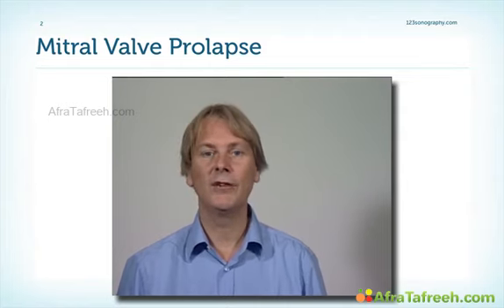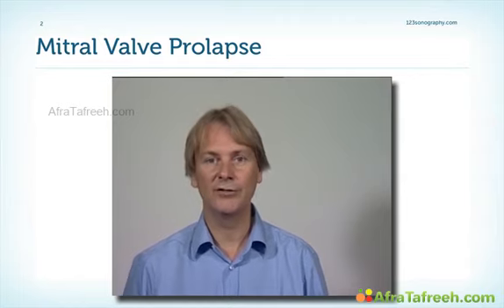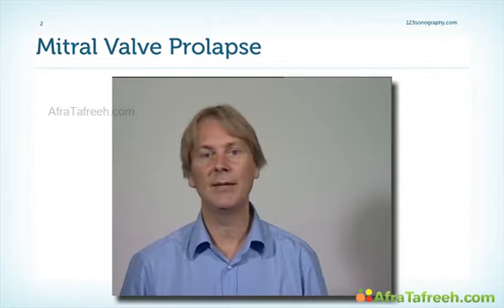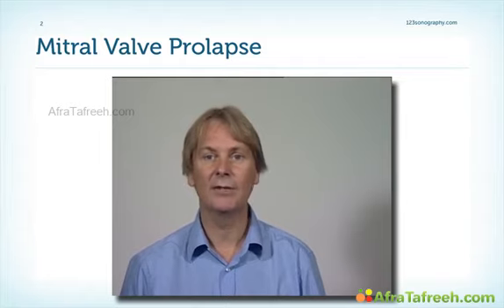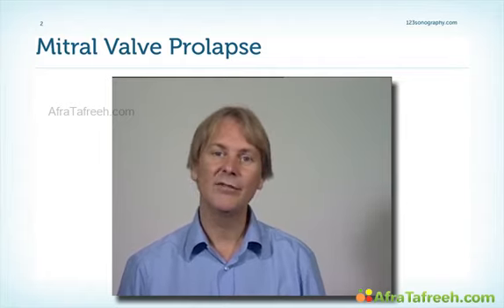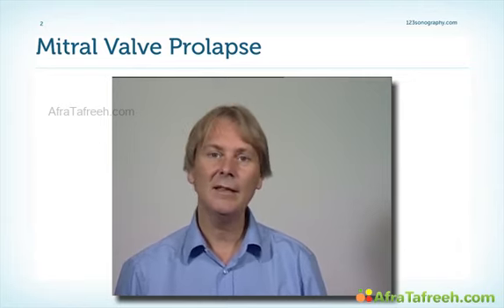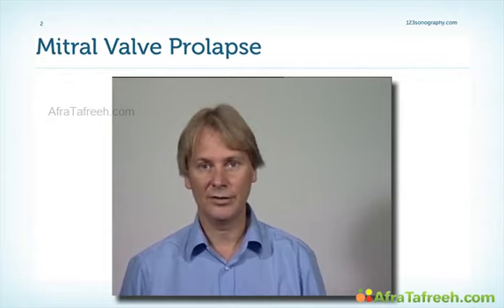I'm sure you too have been confronted by patients who panic because someone made the diagnosis of mitral valve prolapse. And then you perform echo, and all you see is maybe a mild form of prolapse at best with not even regurgitation or only mild regurgitation. Now, it's very difficult to reassure these patients that everything is okay. I think the major problem is that we are just too liberal with making the diagnosis.